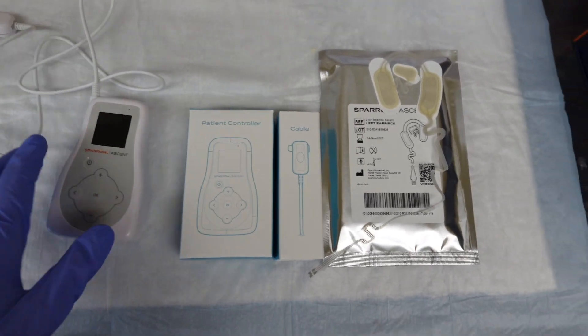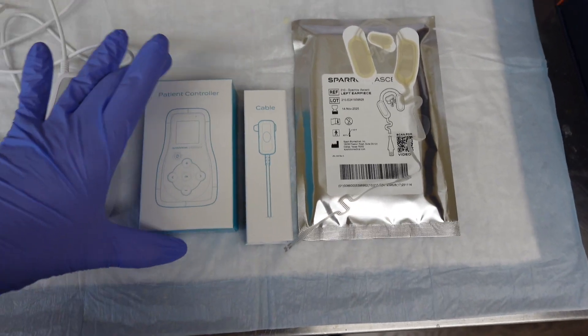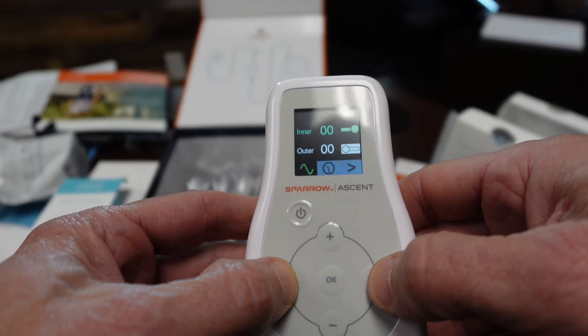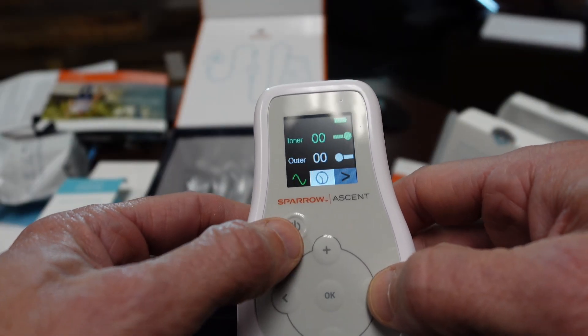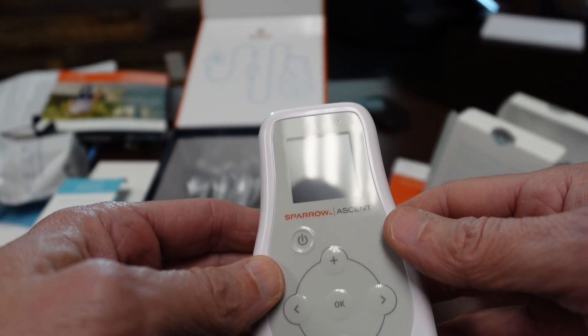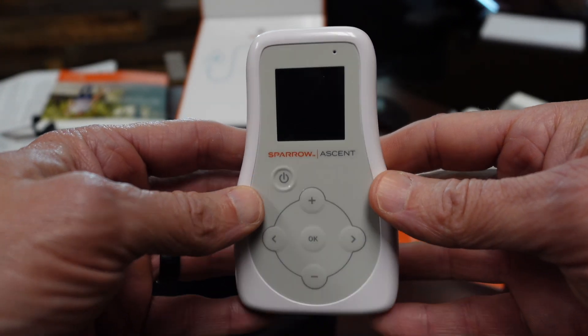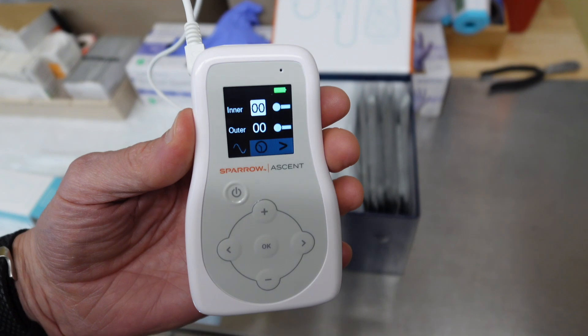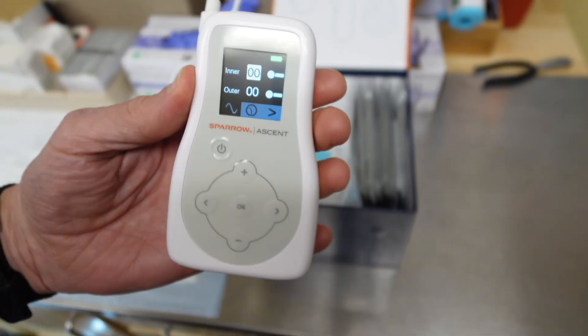The stimulation goes from zero to 50. I have a patient testimonial I'll throw up here in a bit where the guy never really went above 20 — I think he just didn't tolerate it. You can control the stimulation, but it has its own cycle. The cycle is like a five-minute buildup, ten seconds off, and then it kind of winds up and winds down. You can control the time and the amount of stimulation, but you can't control the cycle type — it will always do that.